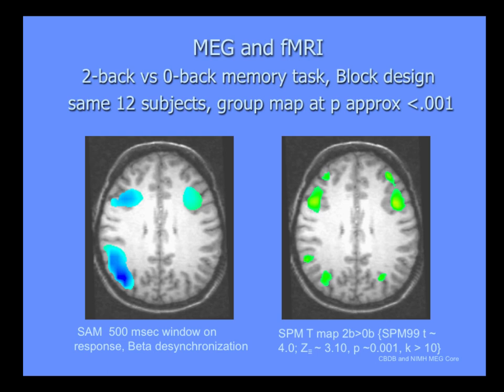And what you see is a pretty classic working memory network of dorsolateral prefrontal cortex and posterior parietal cortex. It's a little hard to truly adjust your P levels to make these comparable between them. But if you're sitting at your AFNI and you can set the slider for your P level threshold, you can also pick any slice in the brain. You can see how quite exquisitely these two maps are the same.